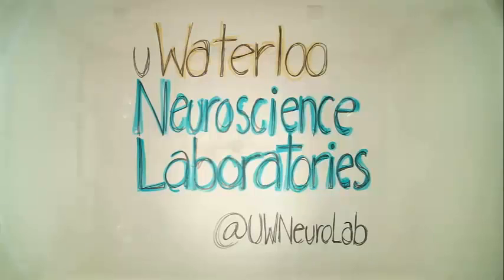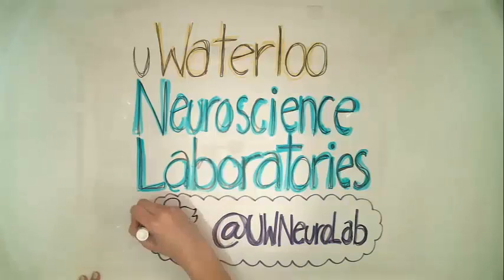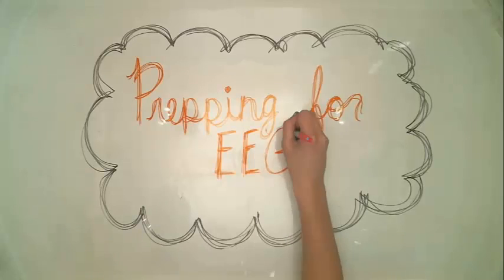This series of instructional videos will help you understand some of the basics of the collection process that we use. In the lab, we implement a number of methods in order to collect certain information about the brain and its processes. Today we will be learning a little bit about prepping for EEG.